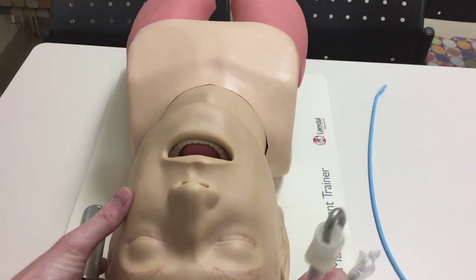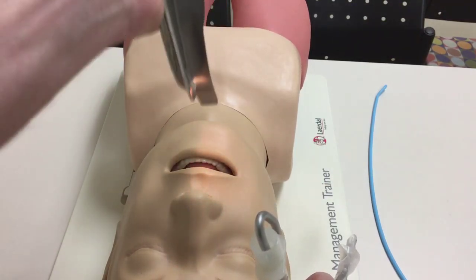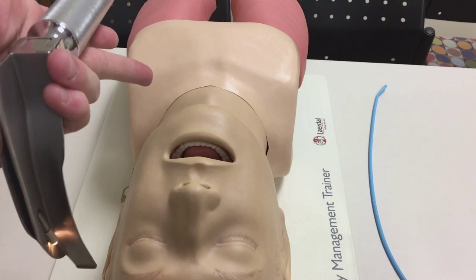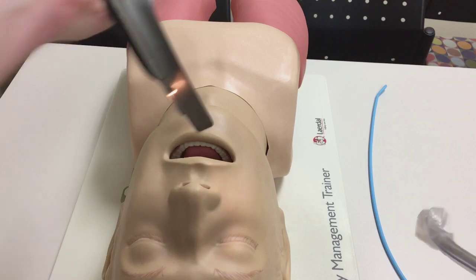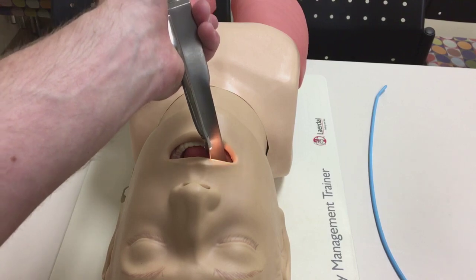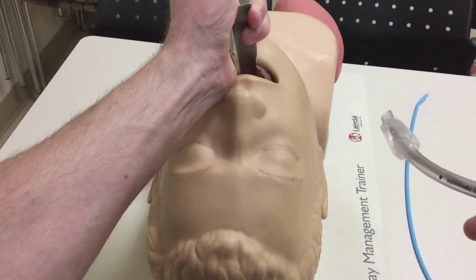Positioning is a big deal — get the positioning correct. If the patient is totally flat, you'll really have to move the anatomy up rather than sweeping it out of your way. Keep them in sniffing position, head back. If you're on a cot, bring them back and let them drop off. Come in from the right corner of their mouth and sweep the tongue off to the side.